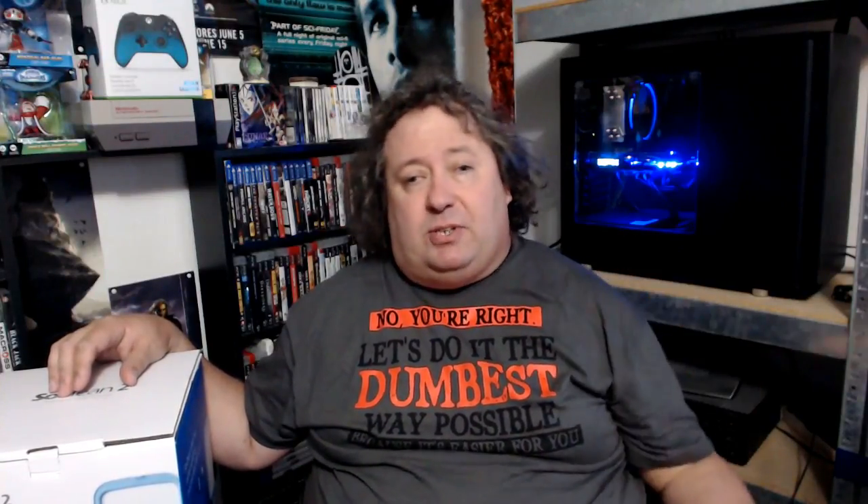Basically what the SoClean is - it's an automated sanitizer for CPAP equipment. It's one of those very hassle-free ways of keeping your equipment clean. Normally if you're like me and you have to use a CPAP mask, you have to wash and sanitize your equipment on a pretty regular basis. You've got to get rigorous about it because you want to keep bacteria out, keep viruses out, and make sure it's nice and healthy.